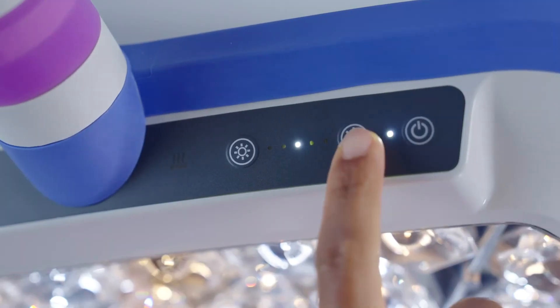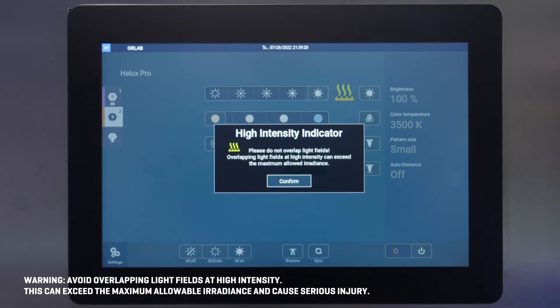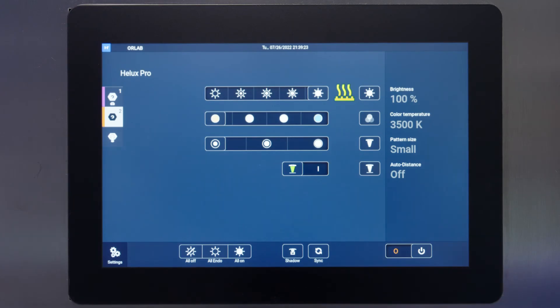If both light heads reach an intensity of 80% or more, the light intensity indicator is activated on both the light head and control panel. Confirm the light intensity message on the control panel to resume using the control panel features. This indicator brings high intensity light safety awareness to the surgical team.